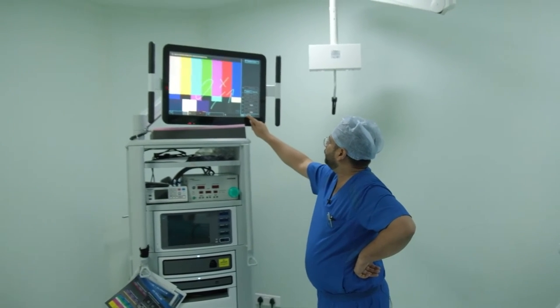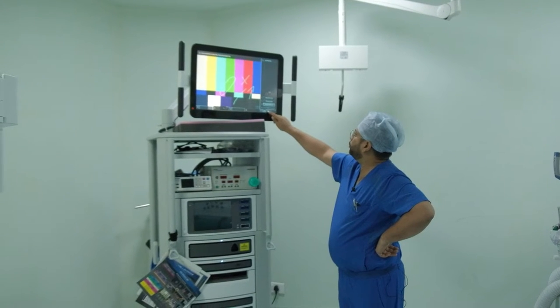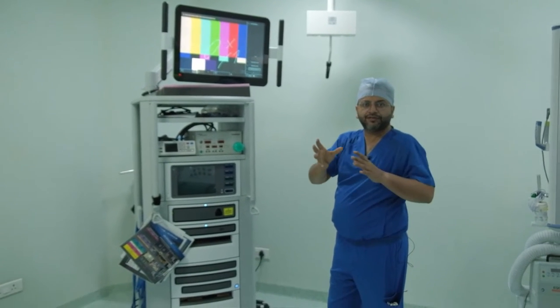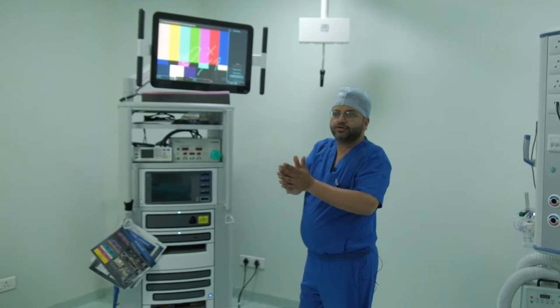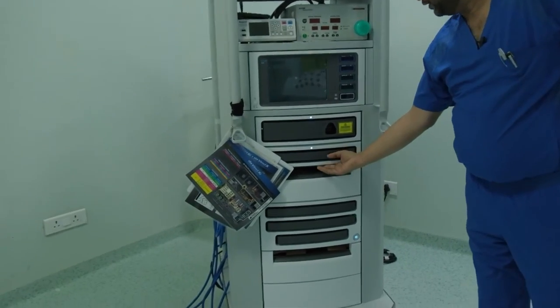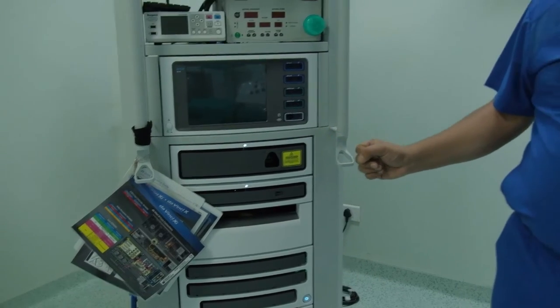There are other options, like we can check the video input, output, and there is a mic here which is going to communicate with the surgeon. Whatever the assistant is saying goes to the surgeon console through this mic and the speaker phone here. This is the diathermy, and here is the video processor unit where the camera will be attached.